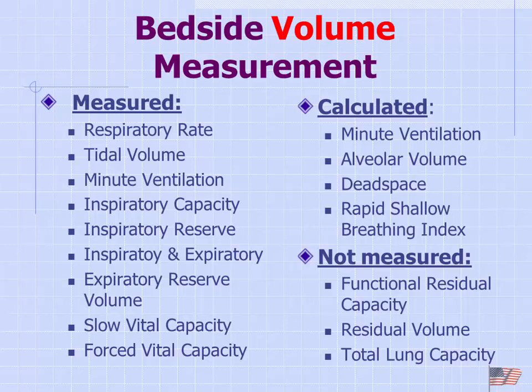The ones you cannot measure with simple spirometry, gee, I don't know how many times you'll see that question on the test: the functional residual capacity, the residual volume, and the total lung capacity. You need lung volume testing to be able to do that. You can't do it at the bedside.